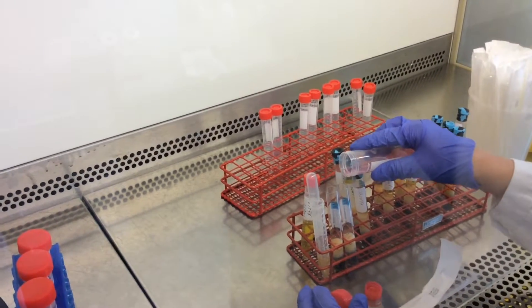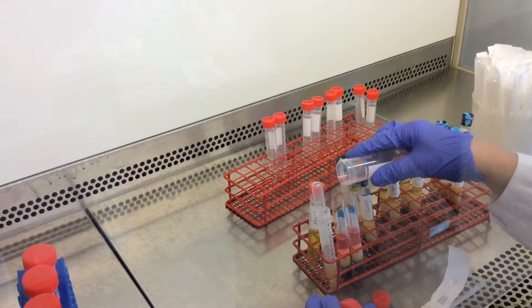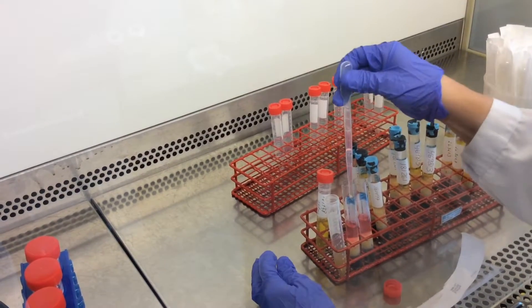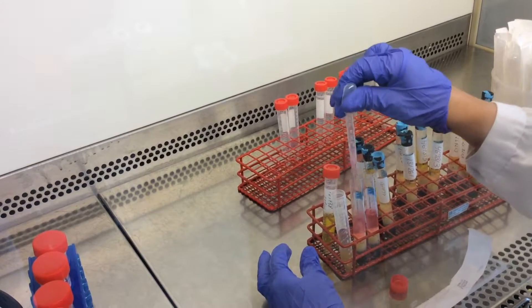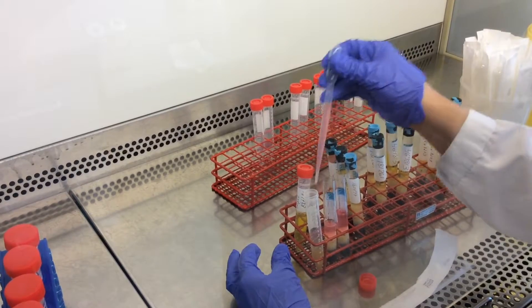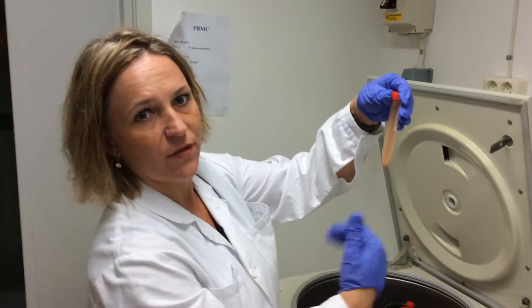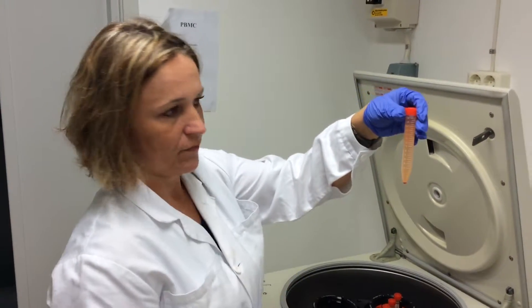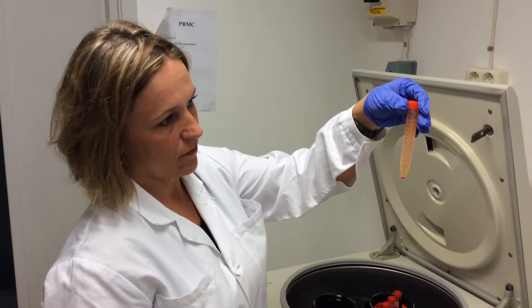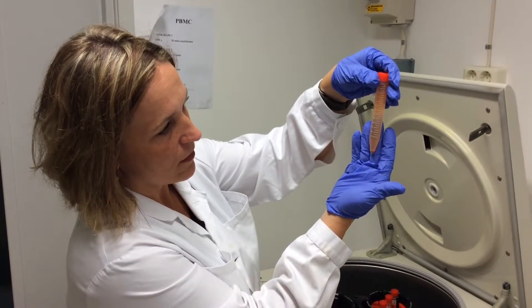She is now adding RPMI media to the tube to collect all the remaining white blood cells. The PBMCs will be washed two times with centrifuge spins in between. Magdalena explains she will remove the supernatant, leaving the pellet of PBMCs at the bottom.